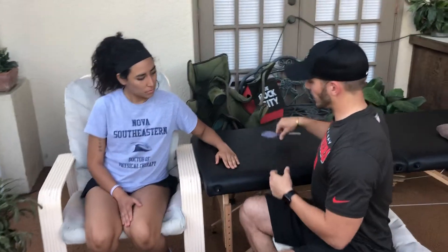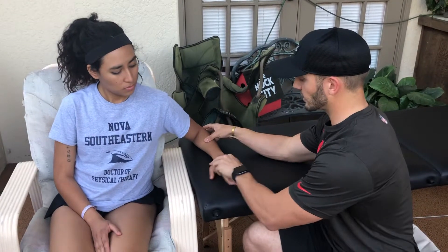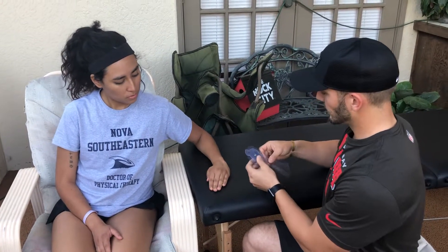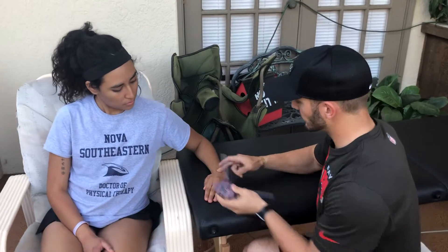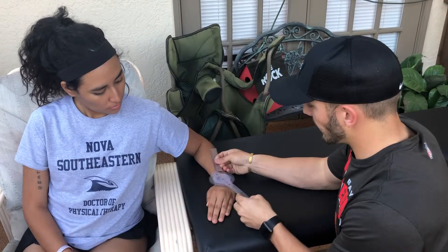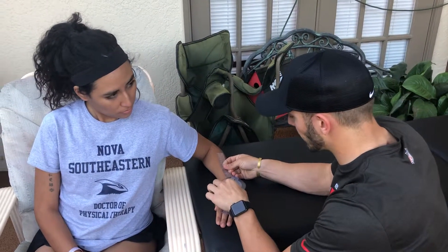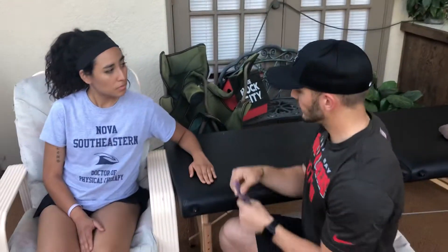So we're going to be doing the upper extremity. I will start with radial deviation — this is going to be a movement like so. My axis of rotation is going to be the capitate. The stationary arm is going to bisect the forearm, and the moving arm is going to follow the third metacarpal. I have 24 degrees. AOS norm is 20.